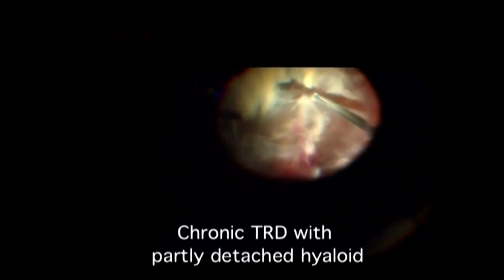This is a case of long-standing vitreous hemorrhage. The classical can opener appears to be through the posterior hyaloid face, but the subsequent wave of separation shows this second layer to be the posterior leaf of the vitreous cortex. This gives us the correct plane of dissection for removal of the adherent membrane over the posterior pole.